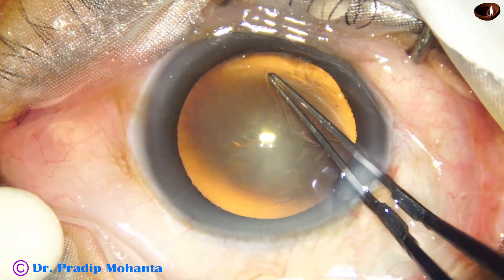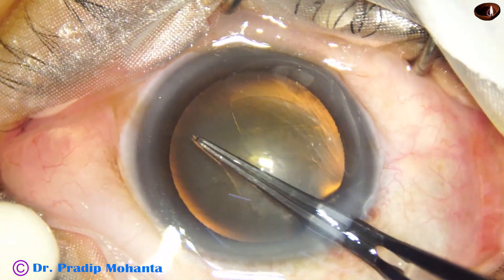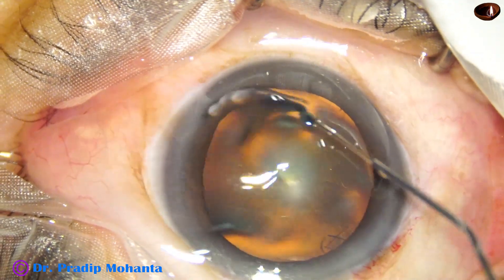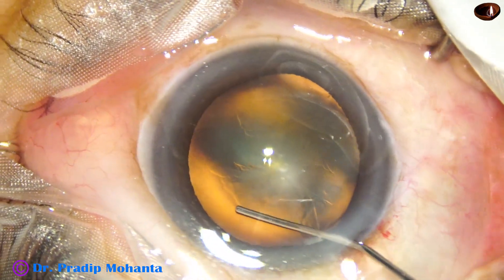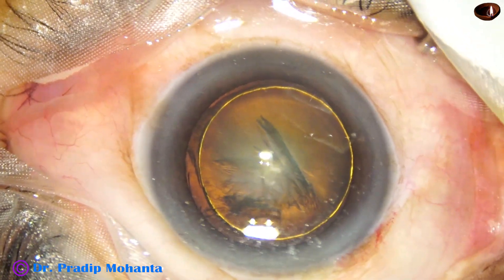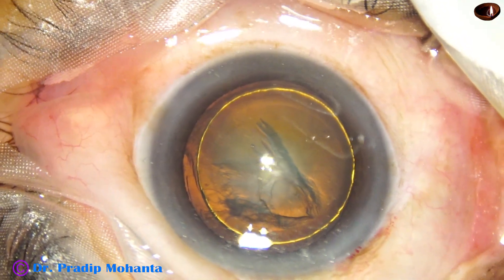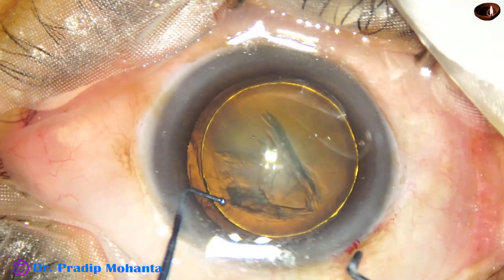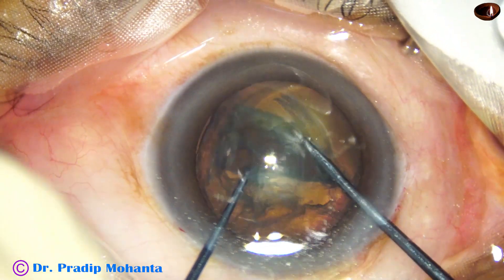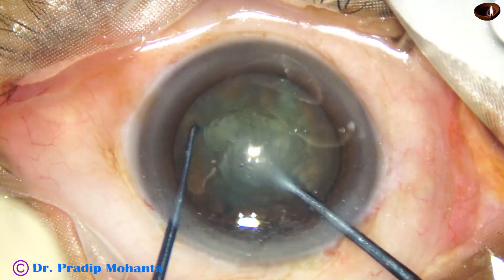First I will use the longer nucleus sustainer, and then for management of the rest of the nucleus I will use the previous 1.7mm nucleus sustainer. Please watch carefully. Hydrodissection is done after capsulorexis. We have got a beautiful golden ring because of hydrodelineation. Now here goes the 1.9mm nucleus sustainer — the pre-chopper tip length is 1.8mm, so it is a little longer than the pre-chopper.